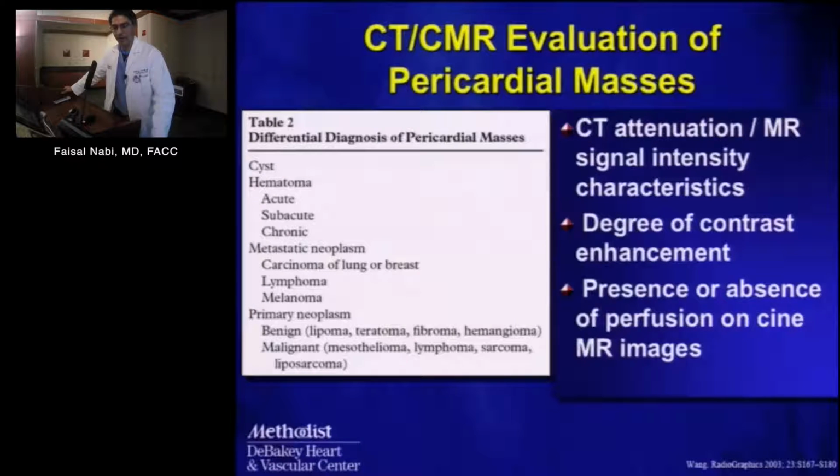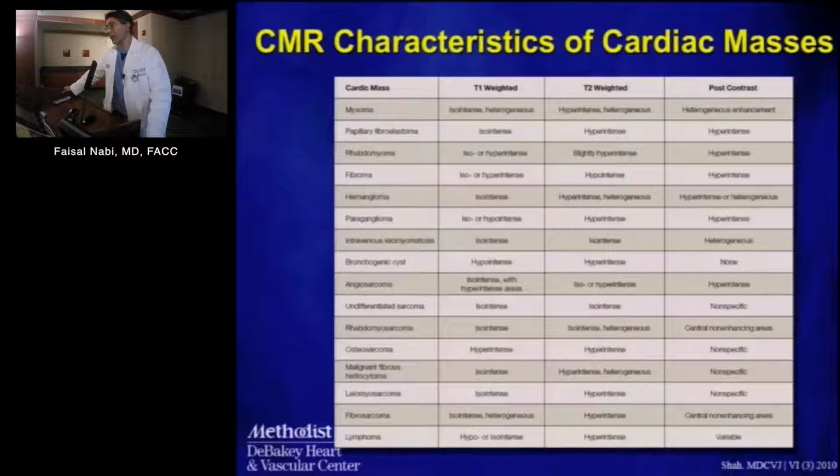So pericardial masses, if you want, I can continue. There are different masses. Dr. Chang and I will be giving grand rounds on pericardial disease, so we'll hit a lot of these, and maybe show some exciting cases. But both these advanced imaging techniques are really crucial to making the diagnoses. CMR is very helpful because of its tissue characteristics.